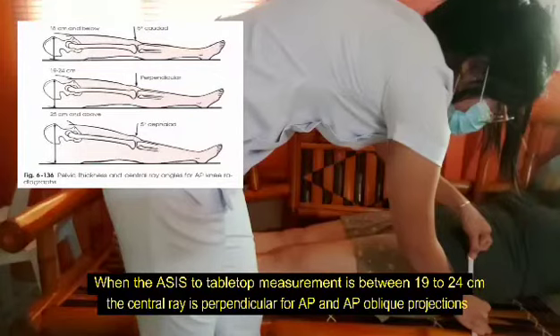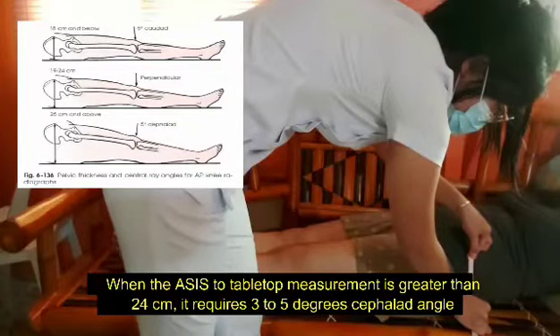When the ASIS to tabletop measurement is between 19 and 24 cm, the central ray is perpendicular for AP and AP oblique projections. When the ASIS to tabletop measurement is greater than 24 cm, it requires a 3 to 5 degree cephalad angle for both AP and AP oblique projections.